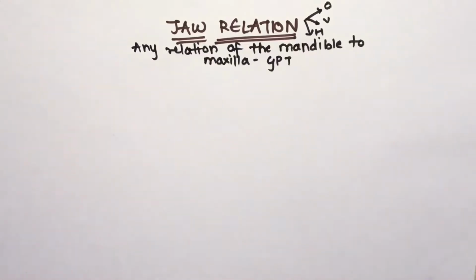Basically, it is important that we realize we are placing these dentures between two bones, and if the denture is not made in harmonious relation with this bone, then it will cause discomfort to the patient. Hence we are making this denture so that it is easy for the patient, and it is dependent on the patient's temporomandibular joint.